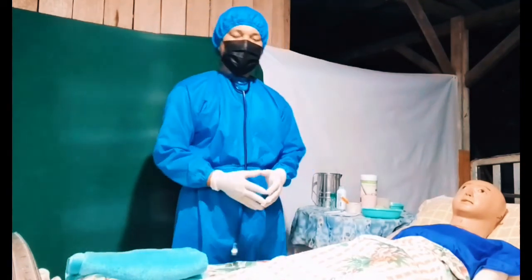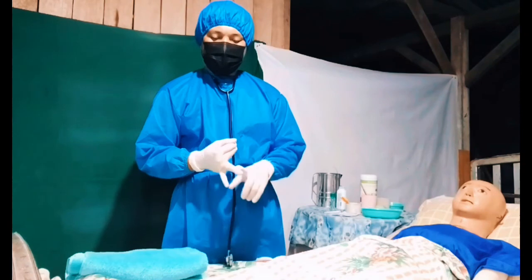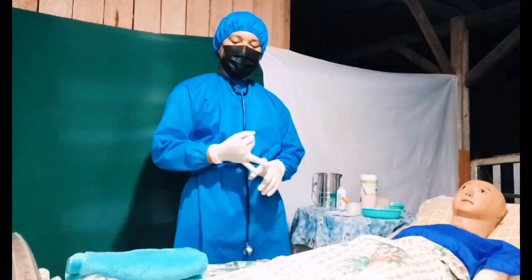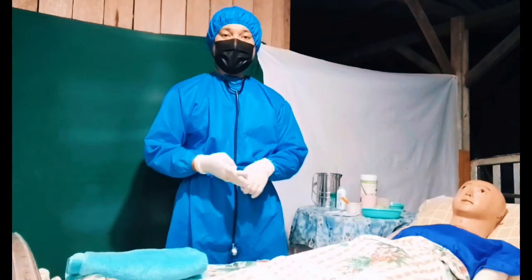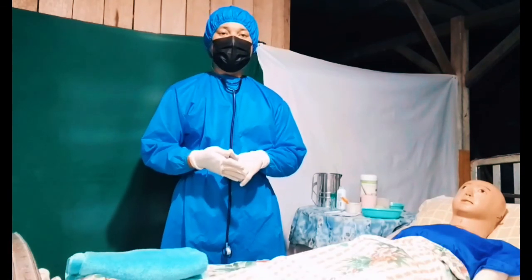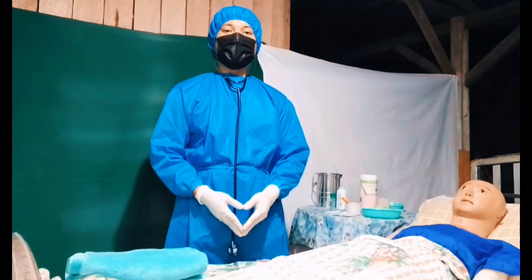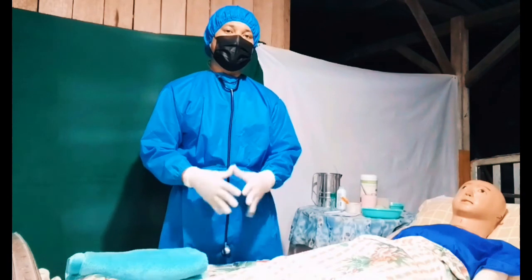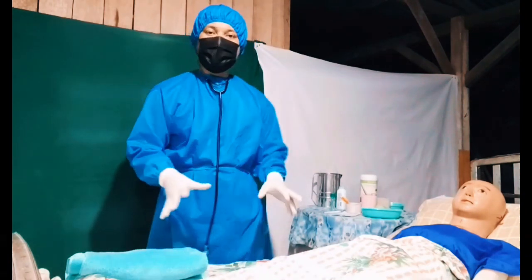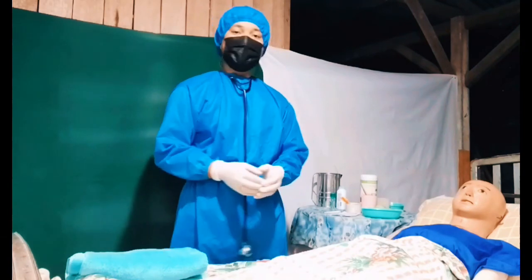And then document the vital signs, the mLs of water, the gastric content color, time and date, and the reaction of the patient. Now we're done doing the nasogastric therapy. Lastly, you're going to clean up the equipment in the room. And that's all. Thank you.